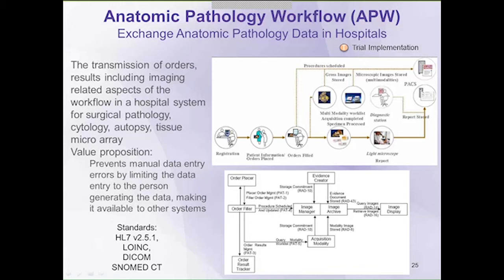There are certainly some European countries that are much more advanced than the rest of the world in this. To name one would be Sweden, who has been one of the leaders. However, most countries and laboratories around the world, the United States included, still base most of their anatomic pathology work using a microscope, glass slides, and tissue that's embedded on that glass slide.